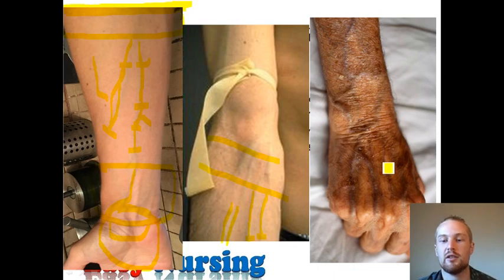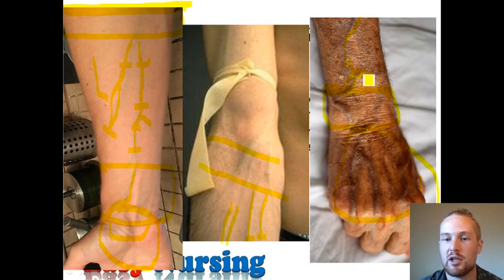Now let's take a look at this other arm. I am going to avoid the hand by all means; that is only the worst case scenario. Looking here, I can see a vein running up here. I would want to avoid here, because if starting here you've got some squiggles. So avoid anywhere you've got those bifurcations. Avoid the bifurcations here, avoid the bifurcations here.